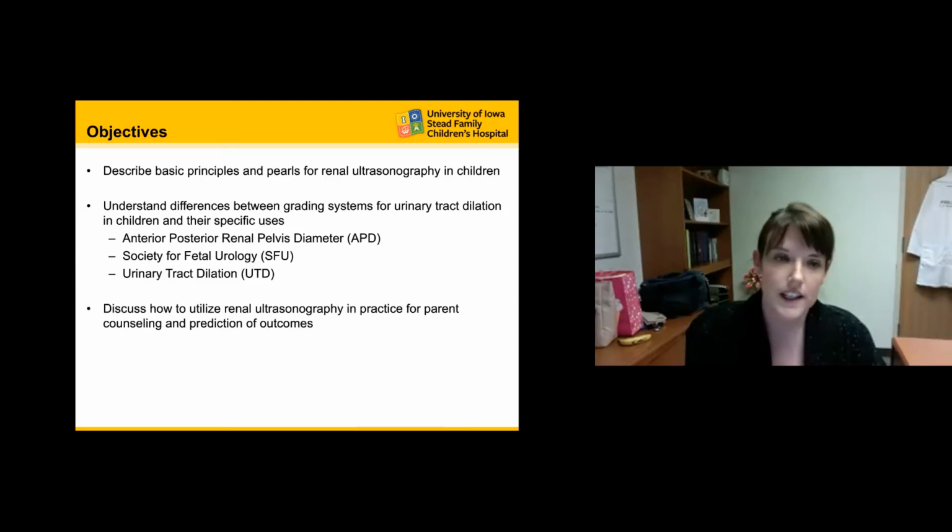We're going to specifically talk about the grading systems for urinary tract dilation, specifically just looking at anterior posterior renal pelvis diameter, as well as the SFU grading system and the UTD classification system. We'll discuss why these different grading systems are important, what their differences are, and how they can be utilized in your practice.